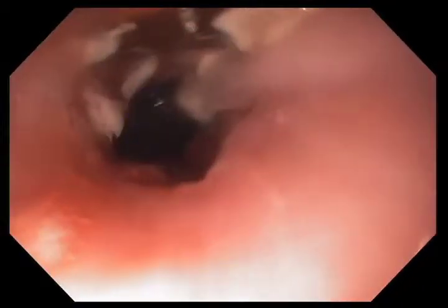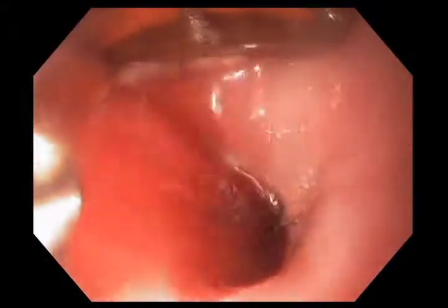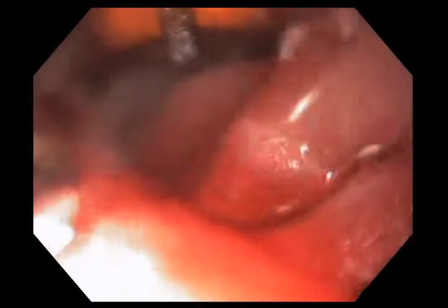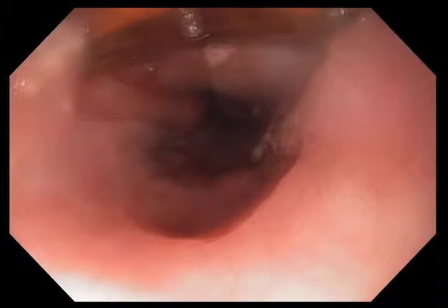Once you've treated it once, there's some eschar, or dead tissue, on the surface of the esophagus. I basically use the device — the baseball cap at the 12 o'clock position — as a scraping device, trying to scrape all of the dead tissue off. The reason is we're going to treat it again; the protocol calls for two treatments in each area, and I want to make as good contact as possible. We're spraying water now as an aid to get rid of pieces of tissue, a little bit of blood — anything that might interfere with good contact between the radiofrequency ablation device and the mucosa. So we're just scraping back and forth gently, cleaning the area as thoroughly as possible.